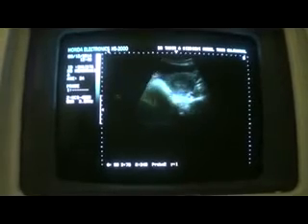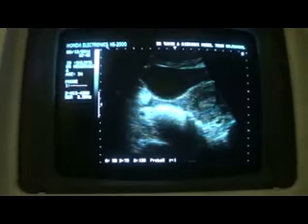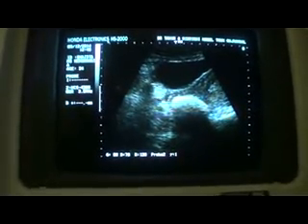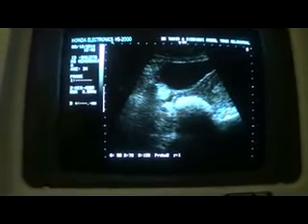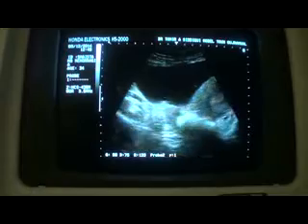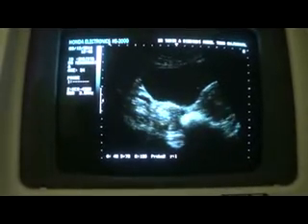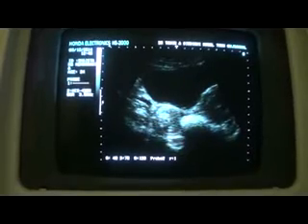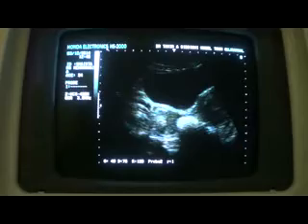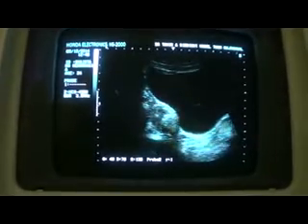Now let's go back to the normal magnification. Right ovary is not seen, so this is relating to the right adnexum. See, there is a small amount of fluid. This is the uterus. This is a small amount of fluid in the region of just the medial margin of the cystic mass. Now, one thing that is important to see is whether this cystic mass changes its shape or not when I sweep the probe about 180 degrees.